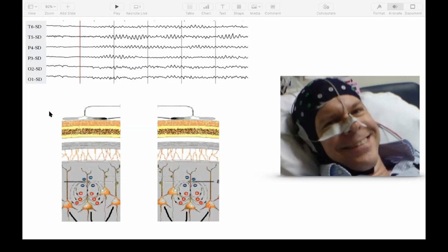And that appears to be very relevant also because the cortex is not only the most interesting part of the brain, but it's also the most vulnerable part of the brain as it comes to energy depletion. And that's what we are talking about today, because patients after cardiac arrest suffered from a temporary energy depletion to the brain. And that is quite directly reflected in the rhythms, as we will shortly see.